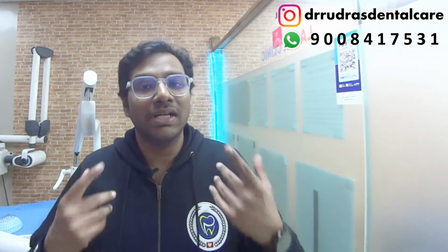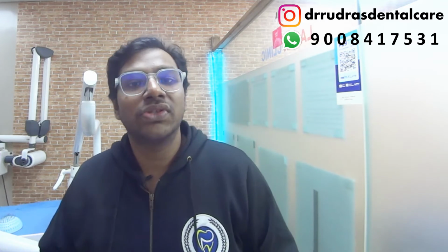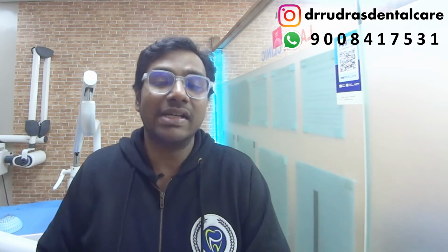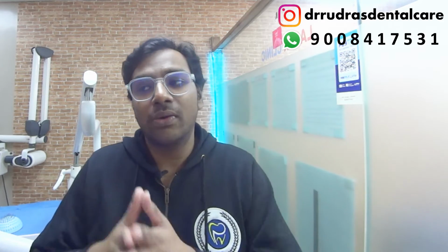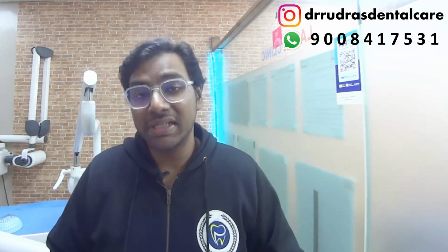You might have some side effects such as excess salivation, you might have jaw tenderness, tooth tenderness, for which you need to make sure that you visit your dentist regularly for getting yourself evaluated. And on top of that, you need to get your sleep apnea study done regularly to see what the epochs are and what the times are that you're having apneic episodes or hypopneic episodes, and how your saturation is working, because it's also been found that mandibular advancement devices have been shown to decrease the blood pressure that you have during the day because your oxygenation is better during the night.